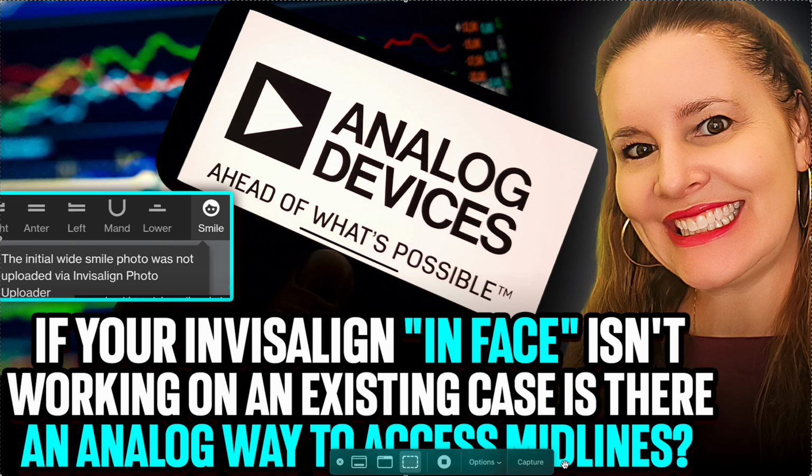So that's the benefit of getting the technology loaded and locked and the data on the front end: we're much more secure about our treatment plan. It's not as much look and sees. Now, of course, there's variables that are going to come into any treatment plan. Variables could be bone density, compliance, if elastics are worn, bruxism, habits, and growth would be a variable too. So yeah, you still got to see your patients. Things can still happen, but you're less likely to have things happen if you use this kind of technology. So that's what the in-face is for.